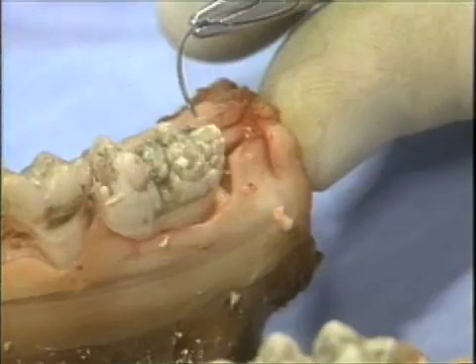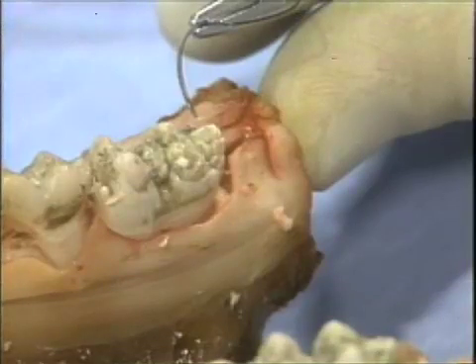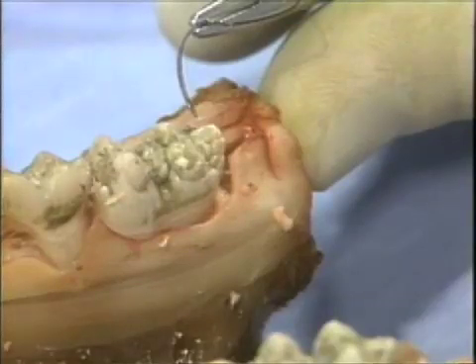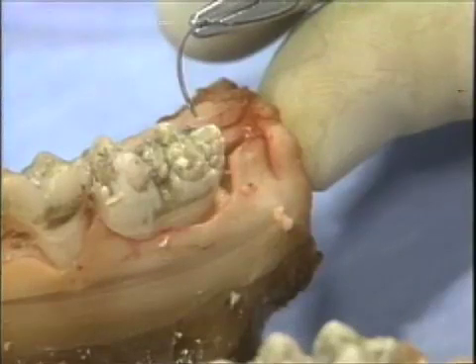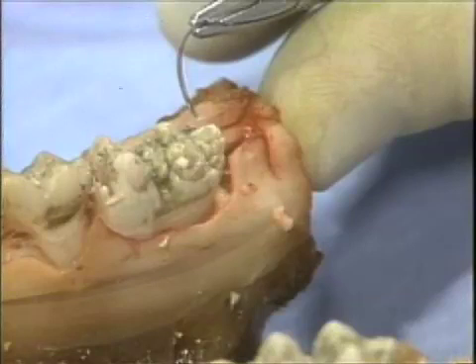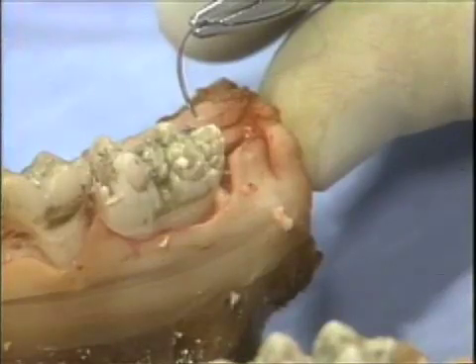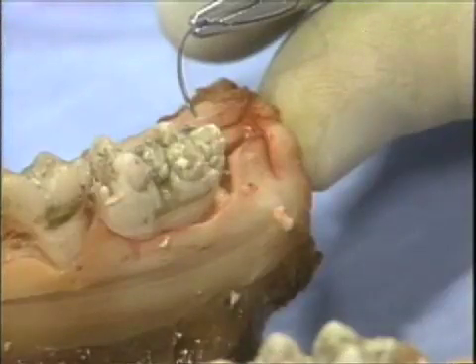The distal wedge can be closed using a variety of suture techniques, including the interrupted loop. However, a useful suturing technique to use in many distal wedge locations is the external mattress suture. In this case, we will demonstrate an external horizontal mattress, which will be used to close a distal wedge performed using two parallel incisions.